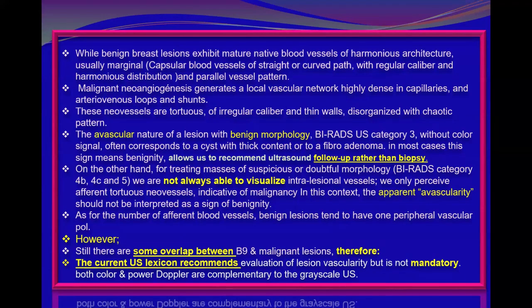As we mentioned, avascular nature of a lesion with benign morphology, i.e. BI-RADS 3, without color signal, often corresponds to a cyst with thick content or to fibroadenoma. In most cases, these signs reflect benignity. So it allows us to recommend a follow-up rather than proceed to biopsy.